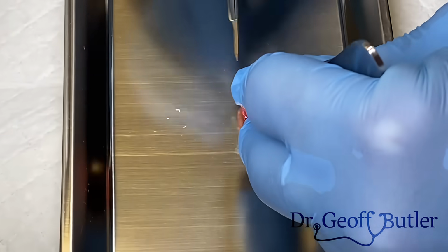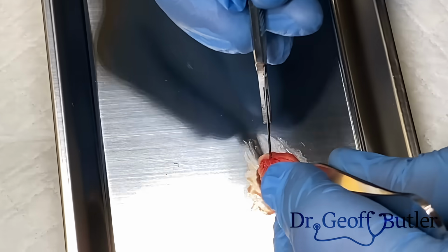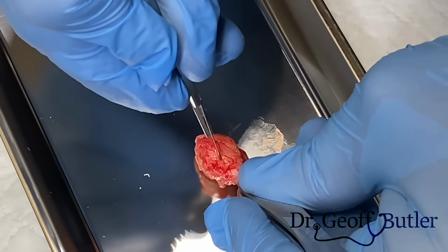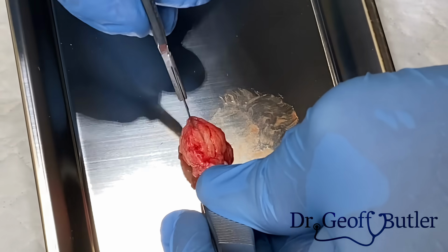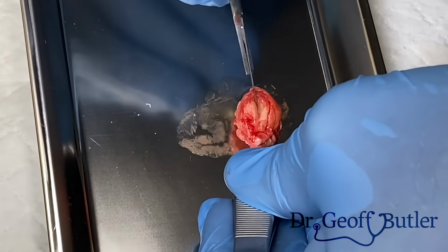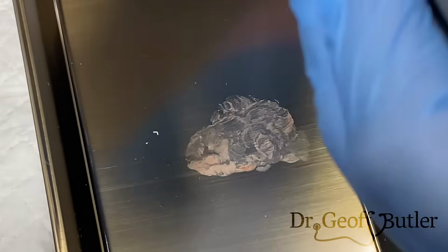So now we should expect, now this swelled a few months ago, so hopefully if it's solidified completely, we should just get firm keratin in this. It's quite firm, actually. Yeah, it's completely solidified. So this is almost like scar tissue through here. So we'll send that off and then sort of see. This is nothing worrisome at all. It's just normal tissue. Keratin's just got a lot of scar tissue through it. But now at least we know that that's completely out.